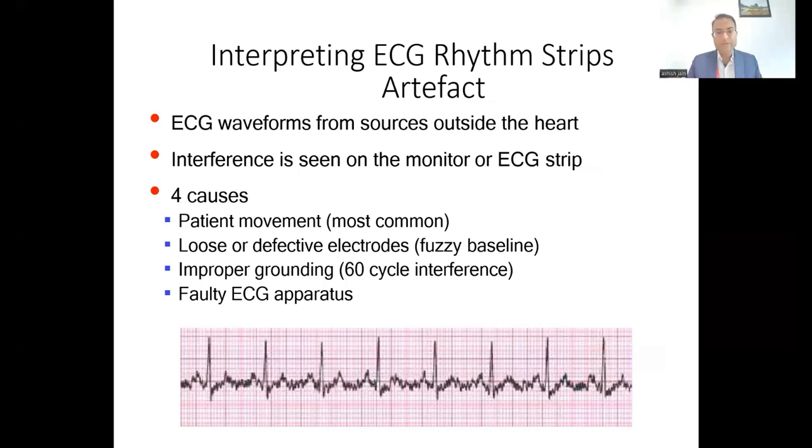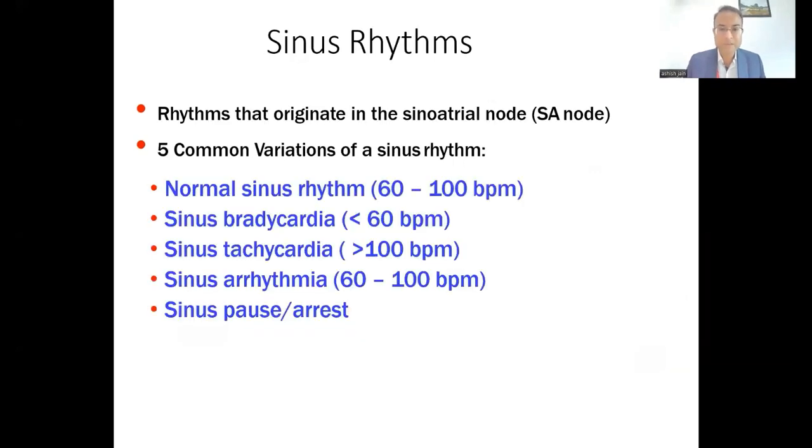Very commonly, we can see this kind of ECG pattern, and it is primarily because of patient movement or loose or defective electrode attachment to the chest wall. So we should discard this kind of ECG.